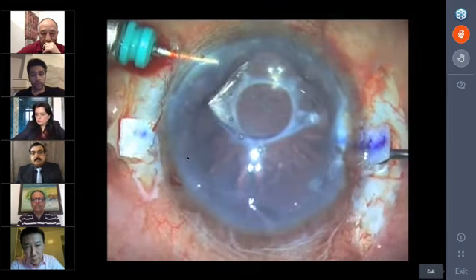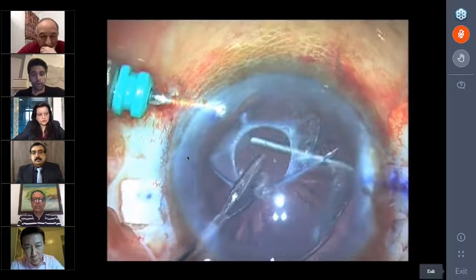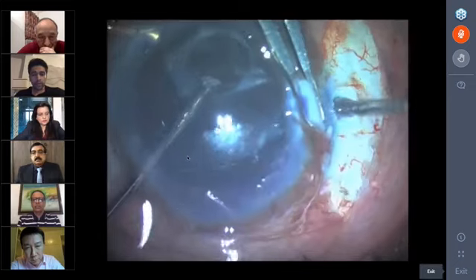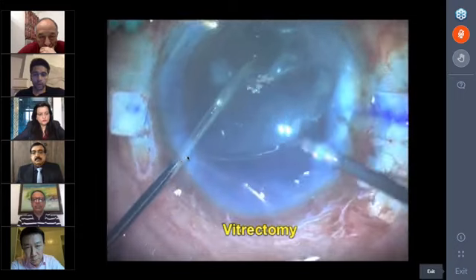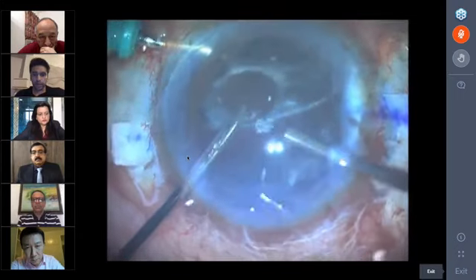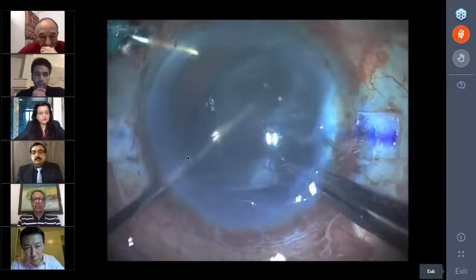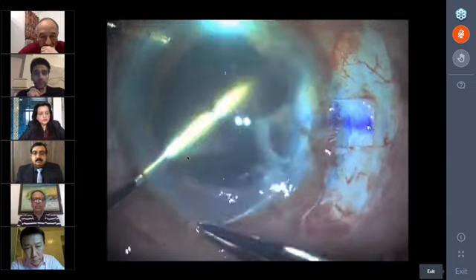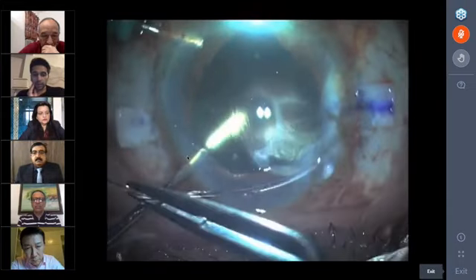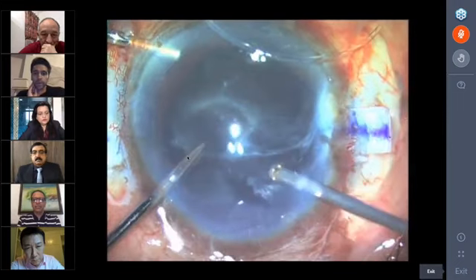So now I'm making my sclerotomies. And once I've made my sclerotomies, I'm using a modified PAL technique to hold and grasp that optic edge. Once I've grabbed that optic edge in place, I'm doing a vitrectomy through the sclerotomy entries that I've made along with the limbal entries. Once this is done, I first found the part where I can grab that endocapsular ring. Now watch what I'm doing here. I'm holding that optic of the lens very, very tightly and removing this endocapsular ring. At this point, I'm feeling very proud that I've held the endocapsular ring, and now I'm doing my vitrectomy through the side port.